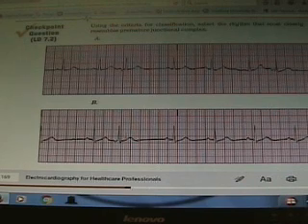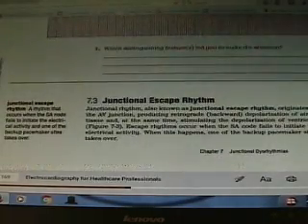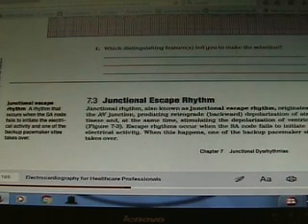I wouldn't ask you to do PJC versus PAC. But you can tell right now. You can do it if you had to, right? So it's not that bad. I can tell you right now, there are a lot of my physician colleagues who couldn't tell the difference between a PJC and PAC. They'd say, oh, call cardiology. No. The next one is junctional escape.